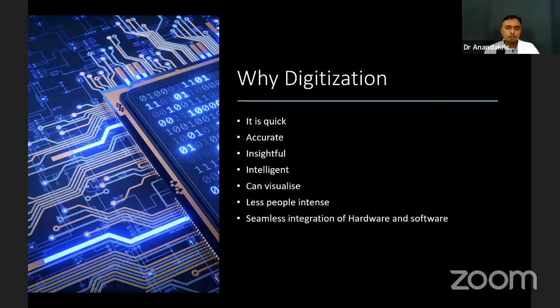Because as a dentist, what do you want at the end of the day? You want peace of mind, because your work is coming out as you expect, and it is coming out accurately. For example, just a single crown, when you talk about prosthetic dentistry, would be very stressful sometimes, because the moment you make the impression, send it to the lab, the die cutting is done, the model is poured, modification, a wax up, probably a metal coping, and then ceramic layering. There are many materials involved here, and there is a lot of expansion and contraction which happens. At the end of the day, the crown which comes back might not actually fit. There are chances that can happen here.